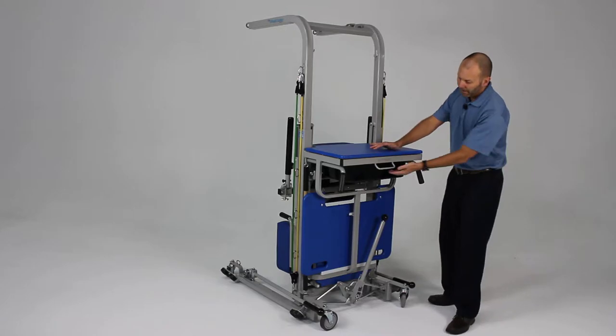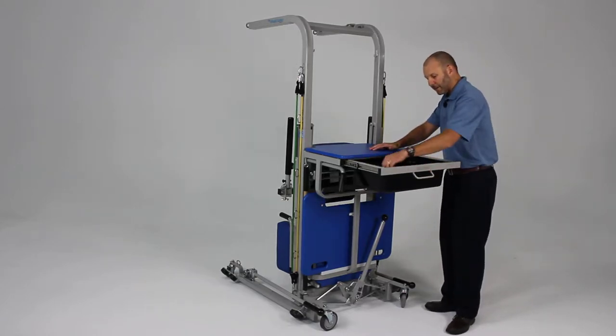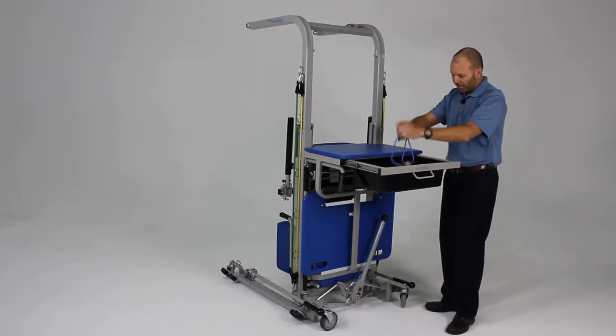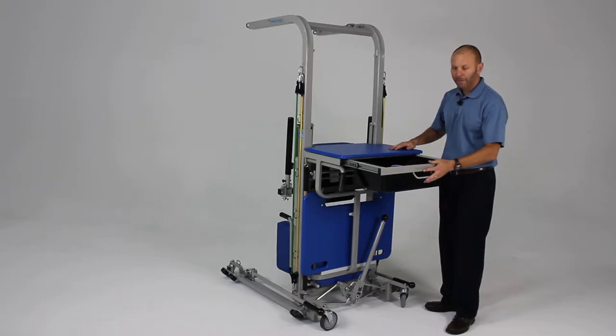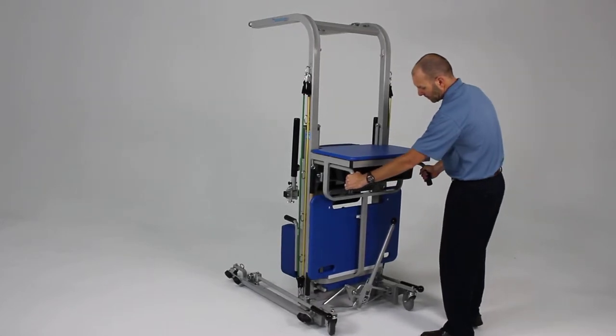Also on the back, there is a drawer that has room for any of the accessories such as the pulley unit for upper extremity range of motion, handles, and any kind of accessories needed for the unit. There are also handles back here that can be used for steering and guiding the unit.